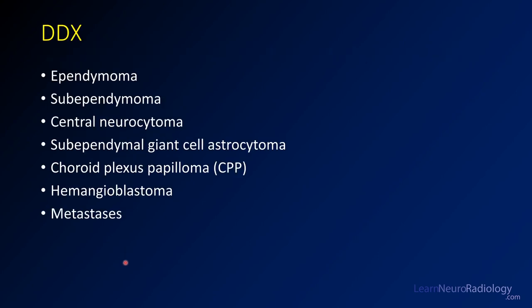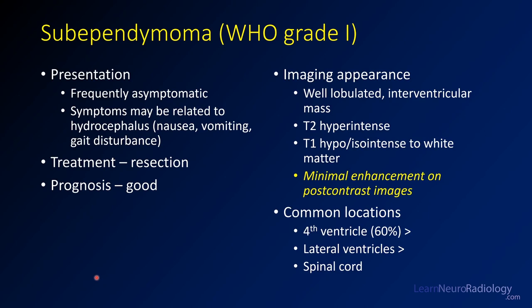This case really has a broad differential. You can have ependymomas or sub-ependymomas that look like this, central neurocytomas can definitely look like this as well, sub-ependymal giant cell tumors (SEGAs) common in tuberous sclerosis patients, choroid plexus papillomas or choroid plexus tumors, hemangioblastomas, and metastases — all in the differential. But it's more classic for one diagnosis, and that's a sub-ependymoma.